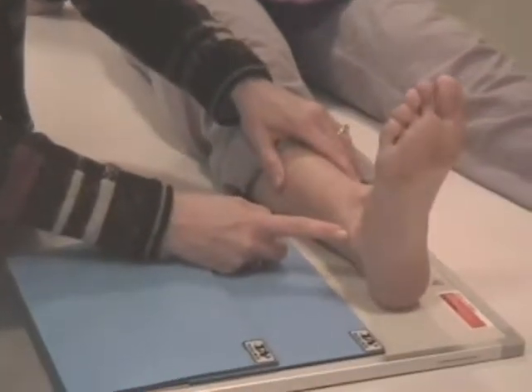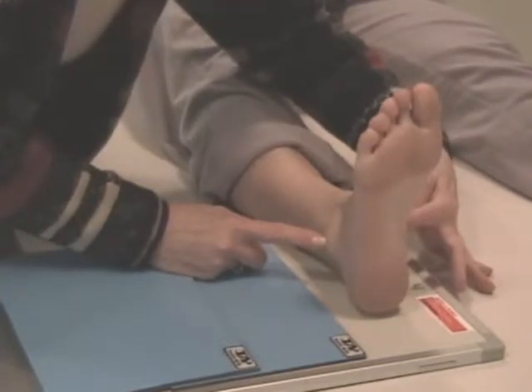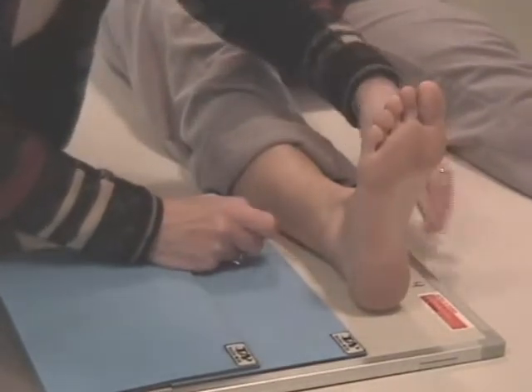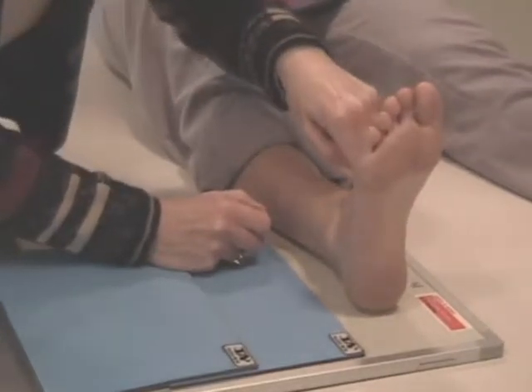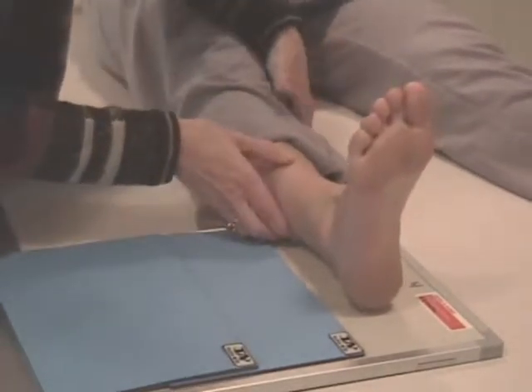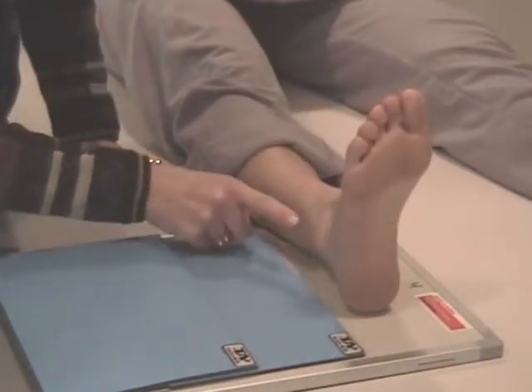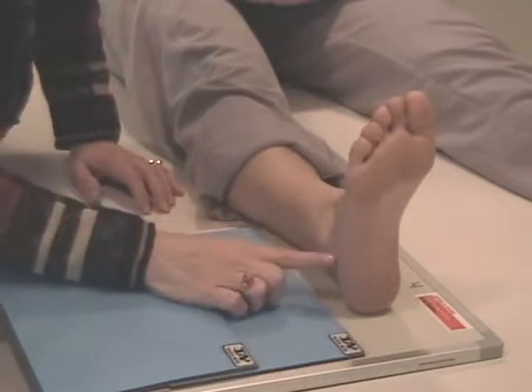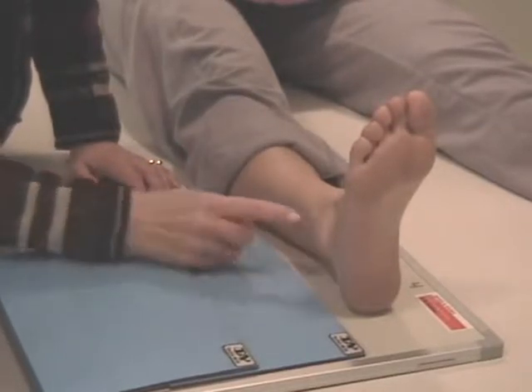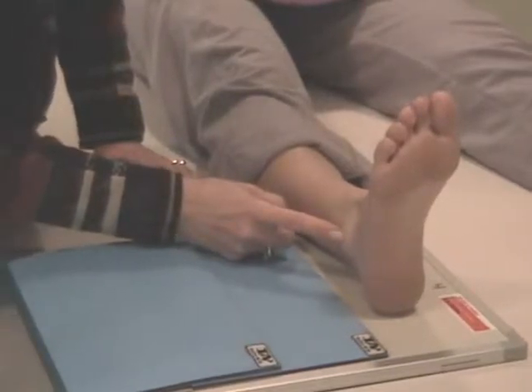And here's a malleolus. I think you can see that. Another malleolus on this side. Okay. Now, the tibial malleolus is pretty much right at the level of the ankle joint. The fibular malleolus hangs more inferior. It hangs beyond the ankle joint. So my crosshair is actually going to be centered a little bit above this bump.